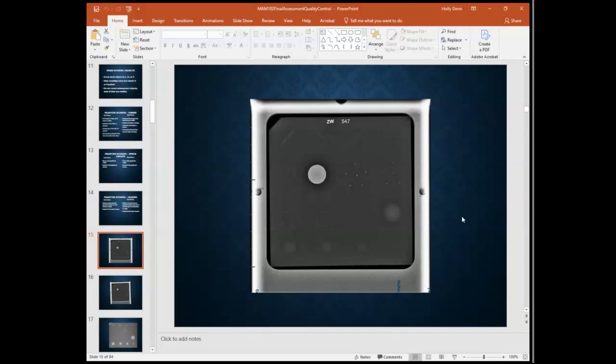So if you don't see all of the specks, it won't count as a full point. Correct. If you don't see at least, what was it, 5? At least 2 to 3 for half a point, and 4 to 6 for the full point. Okay. So this would, in my opinion, on my monitor, still get a full point because I can see 5 of those specks. Okay.